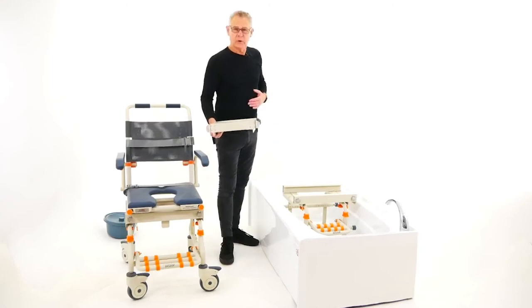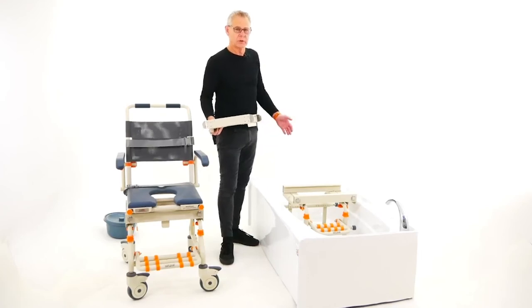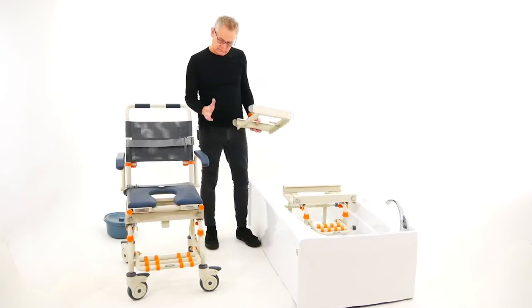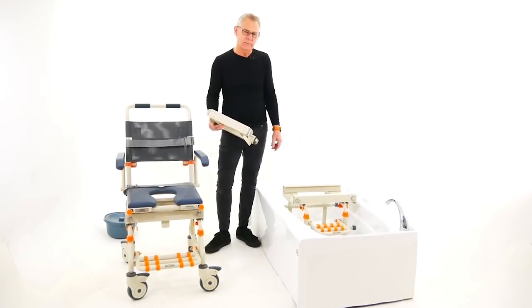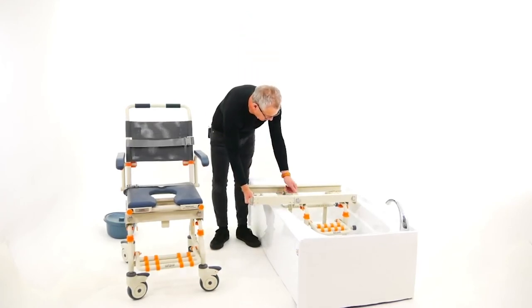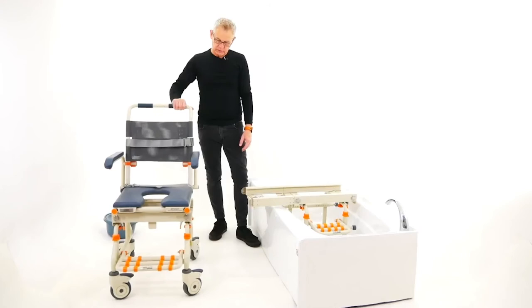Trust me, I've tried all solutions and some of them are very scary. The smaller the track, the worse the feeling for the user during transfer — they're totally in your hands as you're sliding them across nothing. To use the system, set up your bath base, clip in the bridge, do up the latch, and you're ready to bring your chair and user in.